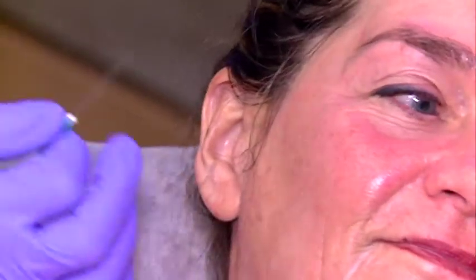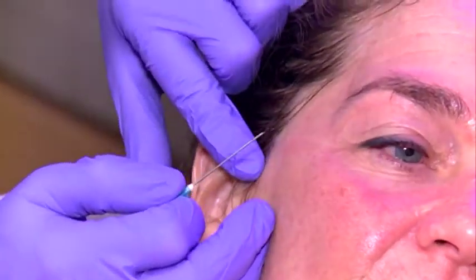Is it better now? Do you need a tissue? Okay, so the only thing you might feel now is a little prick. Should we zoom out a little bit so we can see the full face and keep the patient's breath still?